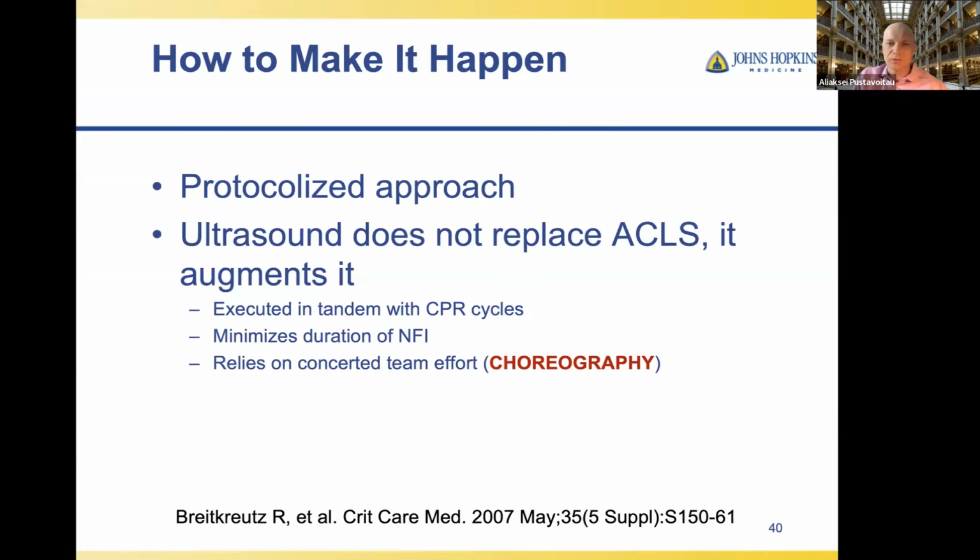So to make it happen, you need a protocolized approach. And we also clearly teach people that ultrasound really does not replace ACLS. It really augments it. It's executed in tandem with CPR cycles. And the training is there to minimize the duration of no-flow intervals.